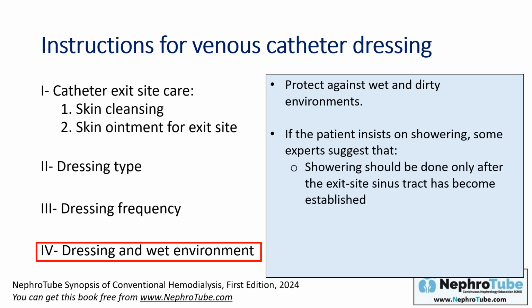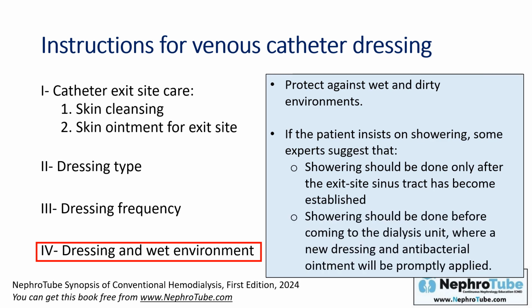Showering should be done only after the exit site sinus tract has become established, and showering should be done before the patient comes to the hemodialysis unit, where the new dressing and antibacterial ointment can be applied immediately after the dialysis session, and we will remove the dressing that is exposed to water immediately before the hemodialysis session.